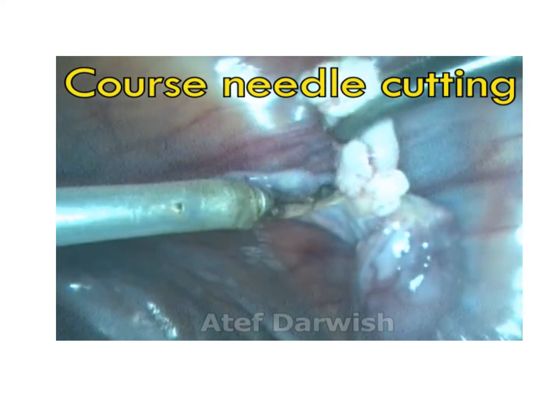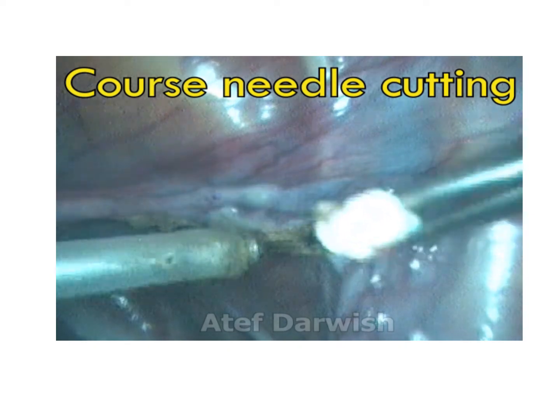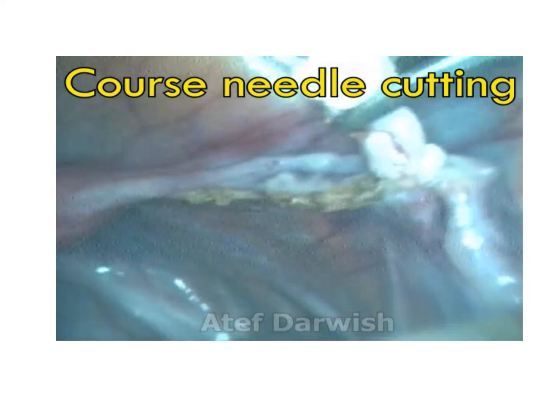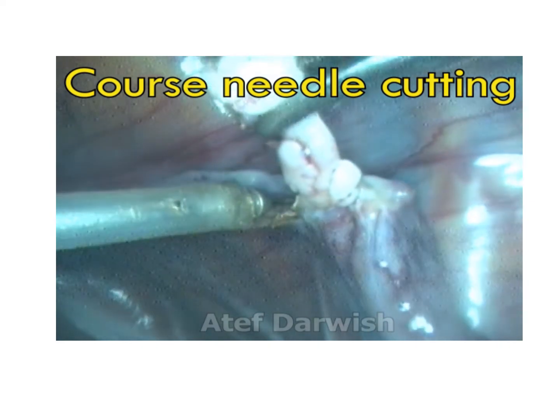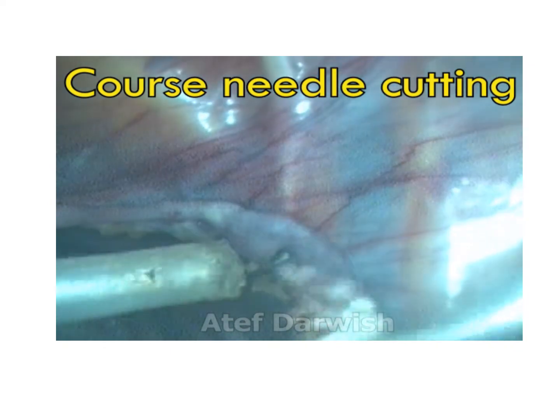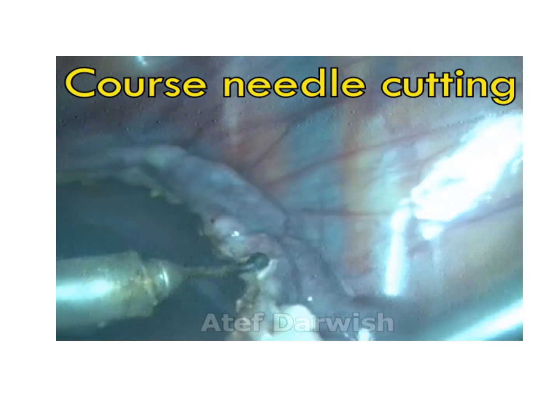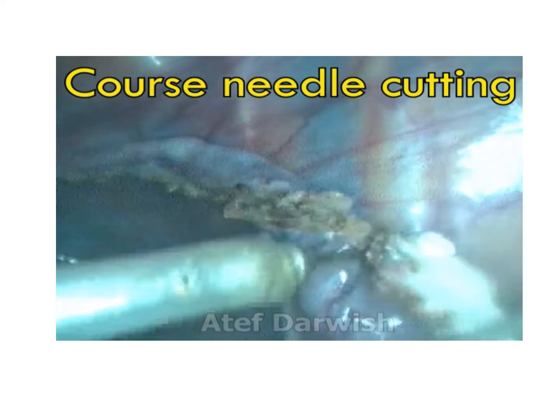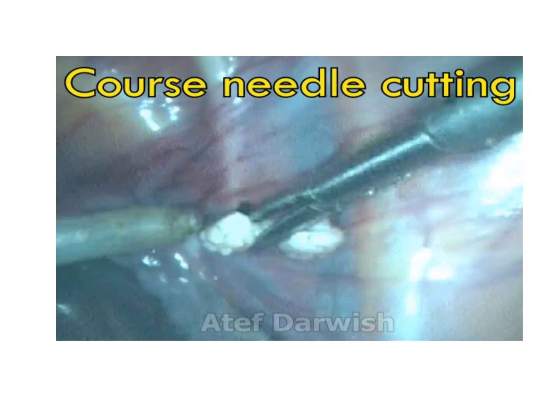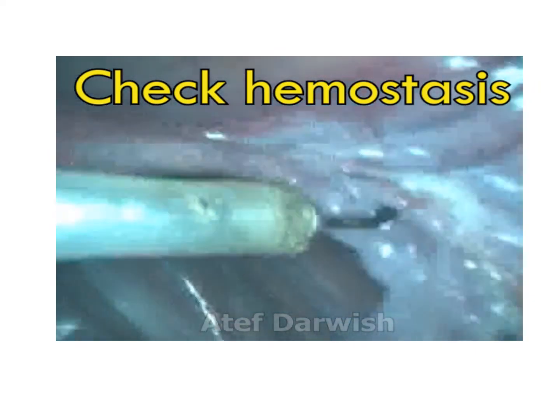Separation of the gonad is performed step by step until it is completely separated from the mesovarium with no bleeding, using this simple technique. Bipolar coagulation of the base of the gonad and surrounding mesovarium is the key to a simple excision procedure. The coarse needle is used to cut the gonad from its underlying structures. When the gonad is separated, it is extracted using a 10-millimeter auxiliary portal trocar and grasping forceps.